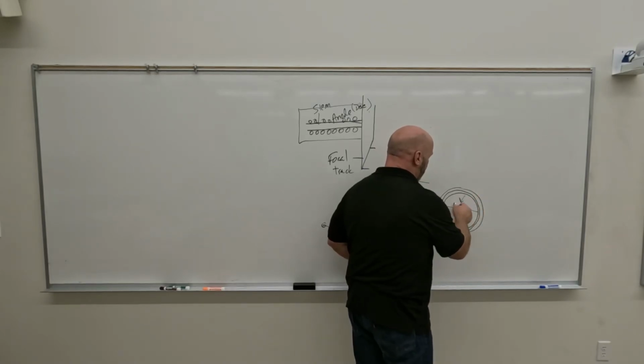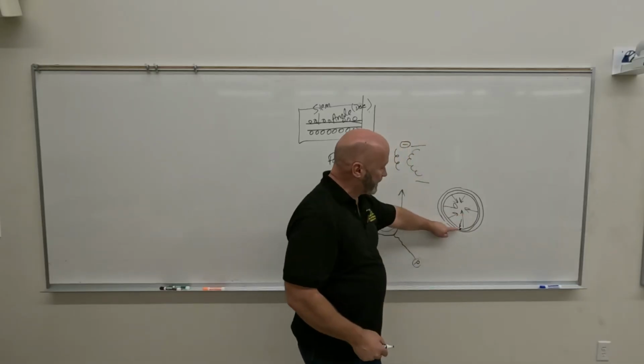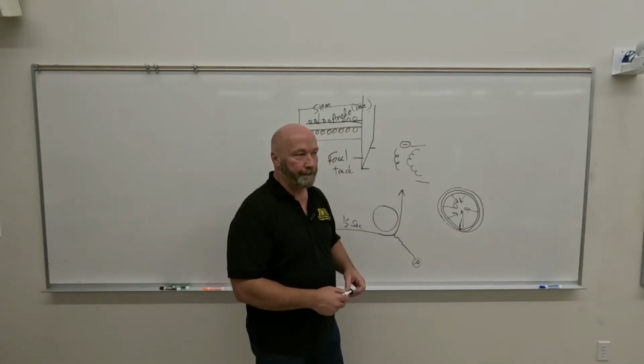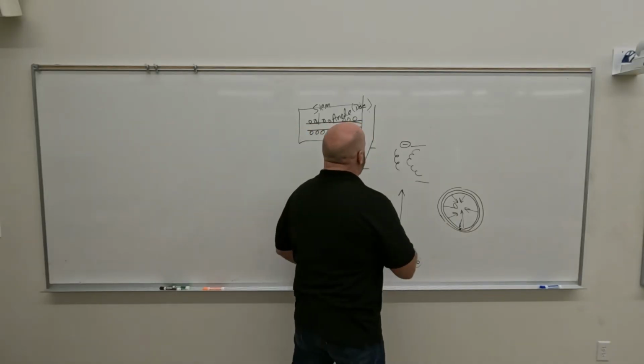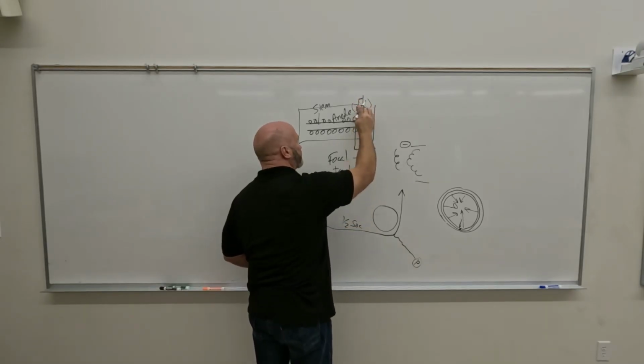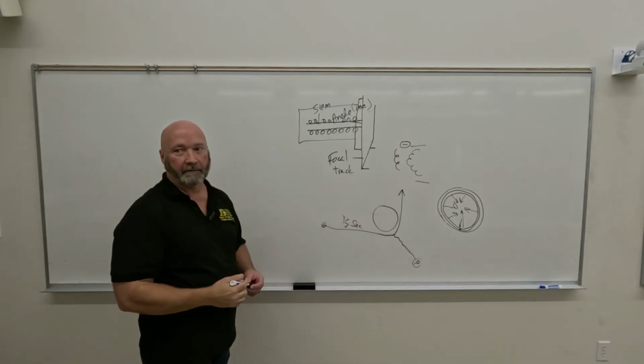Now you've got the area of bombardment catching all the heat, but it can go all over the place, right? Looking at the anode from this dimension, what you might have is a backing that's made out of graphite. And graphite is a poor conductor of heat.